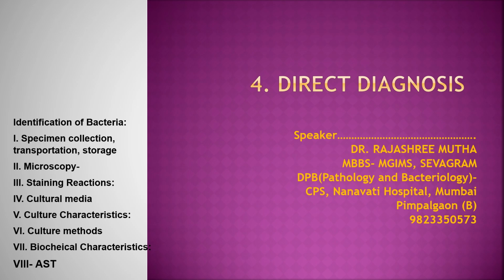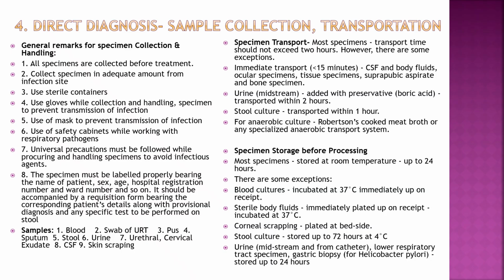Students, let's study direct diagnosis. So first step is sample collection, transportation and storage, and then processing.